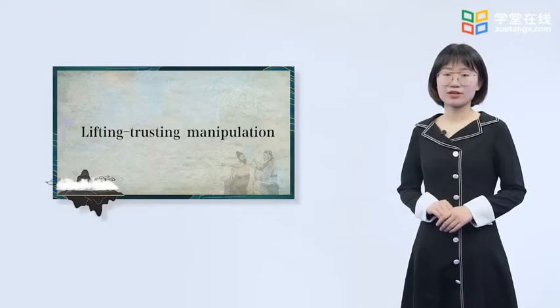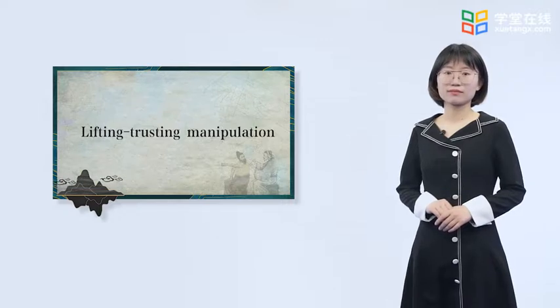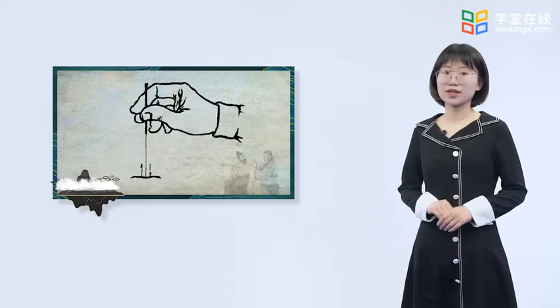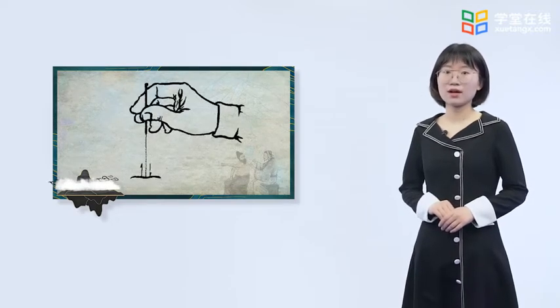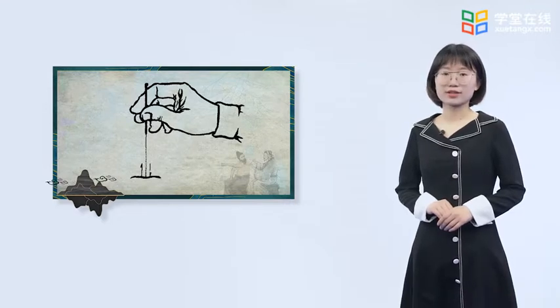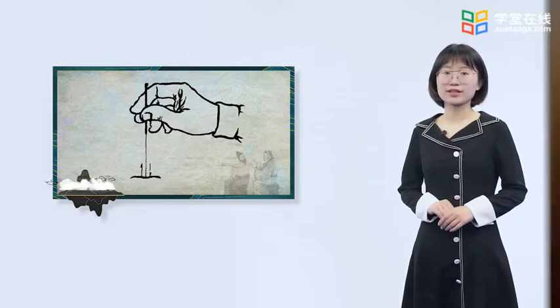Another commonly used method is the lifting and thrusting manipulation. After inserting the needle into the cotton ball, use the thumb and index finger to lift and thrust the needle repeatedly. When doing so, the needle should reach the desired and appropriate depth.